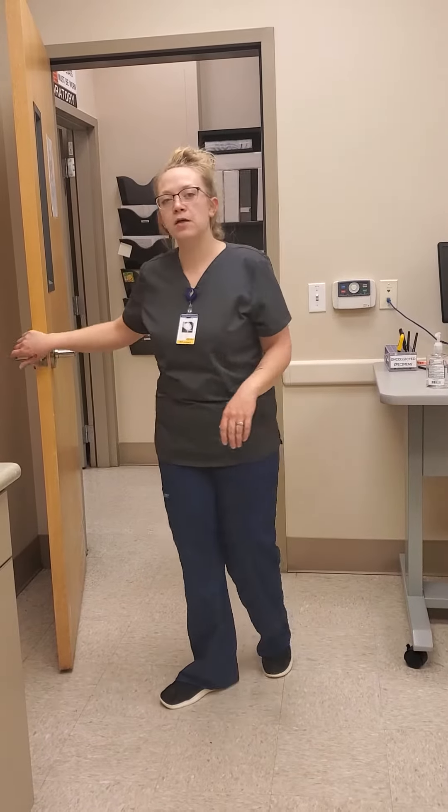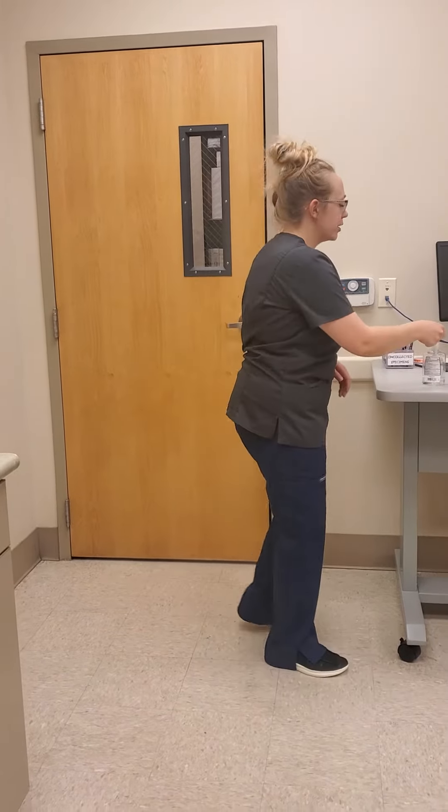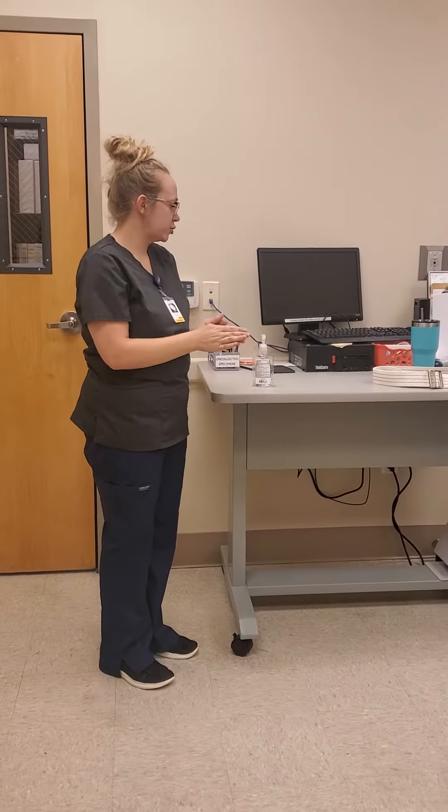Hi, I'm Jacqueline. I'm going to be helping my patient today ambulate using a gait belt. First, I'm going to shut the door to ensure patient privacy. I'm going to use some hand sanitizer and rub it in until they're fully dry.